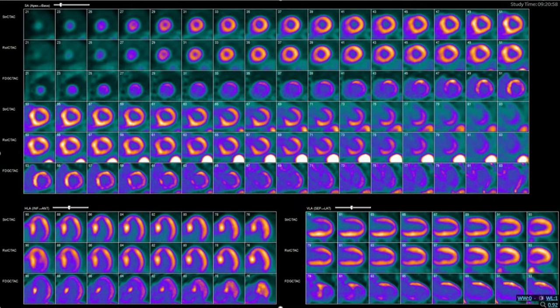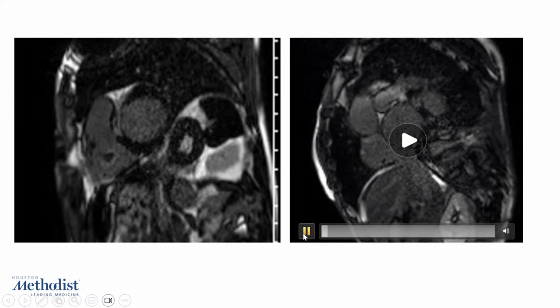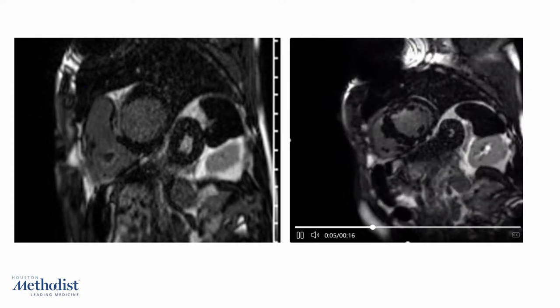So inflammation, although we always tend to think sarcoid, you also have to think about a lot of the mimickers. One of the mimickers that has been suggested is amyloid, if it is faint uptake. There are other reports about some of the HCM mutations causing some local inflammation in these cases. So if you go back to the LGE, maybe the MRI readers, does anyone think this is an HCM kind of, or amyloid HCM kind of LGE pattern?